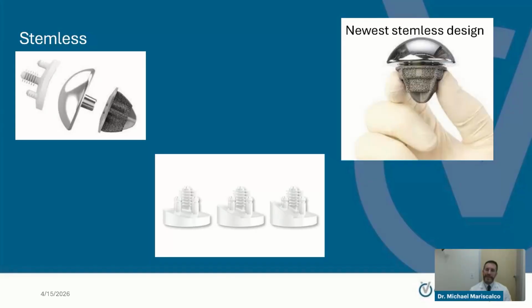There are augmented glenoid or socket components that have built-in corrections that CAT scan software can help plan and account for at the time of surgery. So if there is substantial deformity, it is very beneficial for the surgeon to know that ahead of time and plan, and then potentially use one of these augmented glenoid components to correct that deformity at the time of surgery.